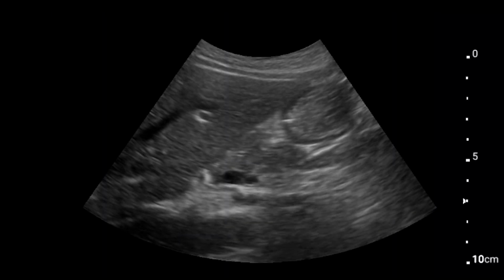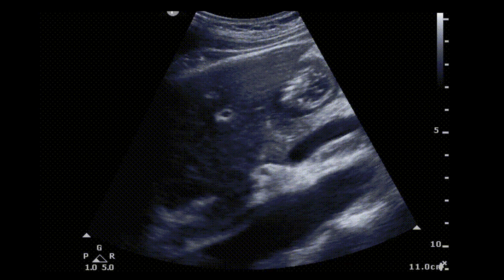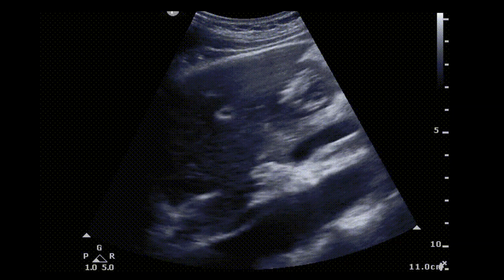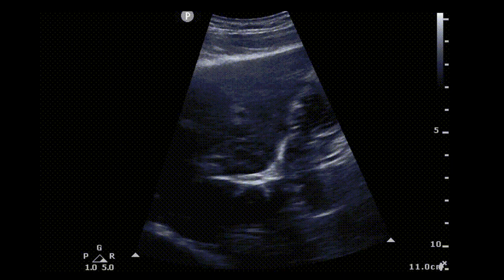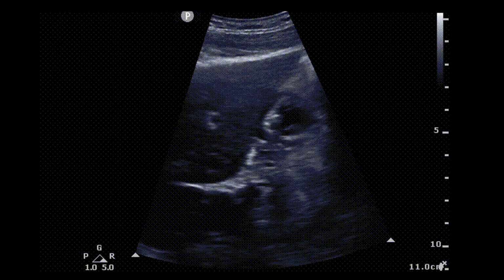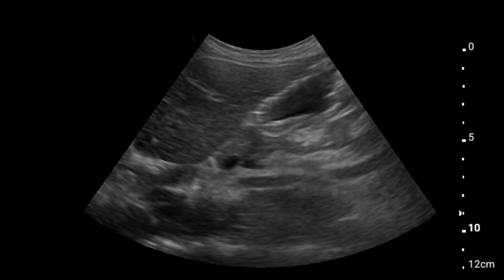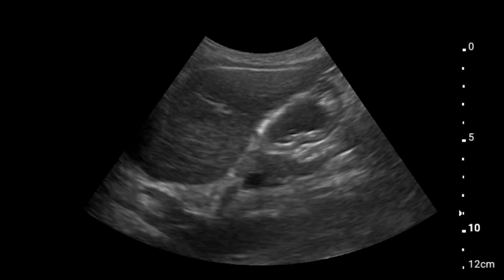on ultrasound. Multiple floating small air bubbles appear hyperechoic within the sea of blackness and give a starry night appearance, which is what we see on this example. You'll feel thirsty after a whole day in the OR and decide to have a large volume of water, and your gastric antrum begins to distend. The normally thick hypoechoic wall becomes thinned out and round, and this is what we appreciate on this next example.